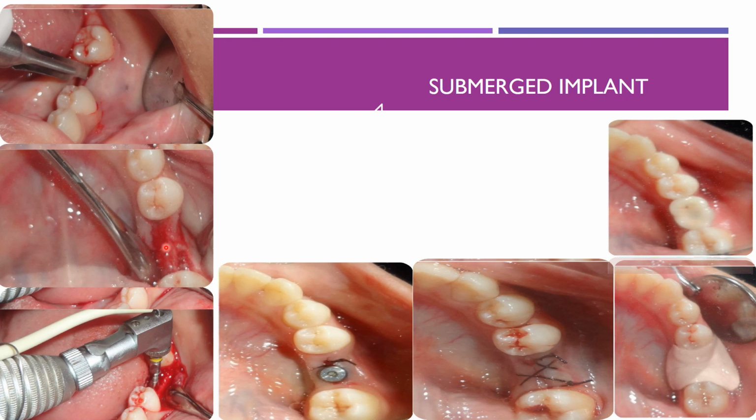So if it is very knife edge, you can do contouring or flattening of the bone with a large round burr. Okay, then we are moving on to the series of drills used to prepare the osteotomy site precisely. You can see that with the varying sizes, we will be reaching the desired depth, and then we will be using different drills for widening the area. And then the implant has been placed.